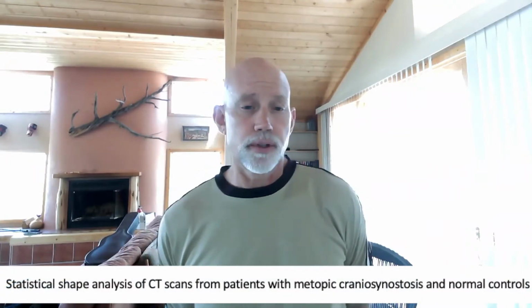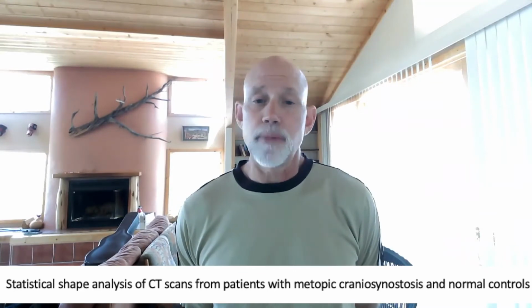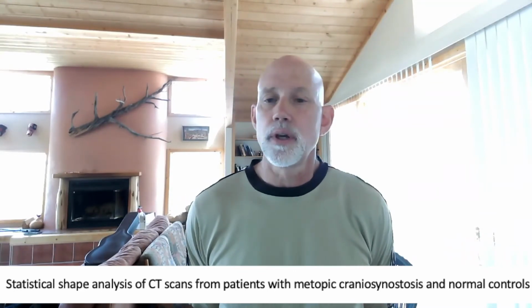This technology uses statistical shape analysis of head and skull models derived from sets of 3D images. We first built a statistical model of pediatric skulls from CT scans of children, some of whom are patients with metopic craniosynostosis, and some of whom are normal controls in order to capture normal phenotypical morphologies.